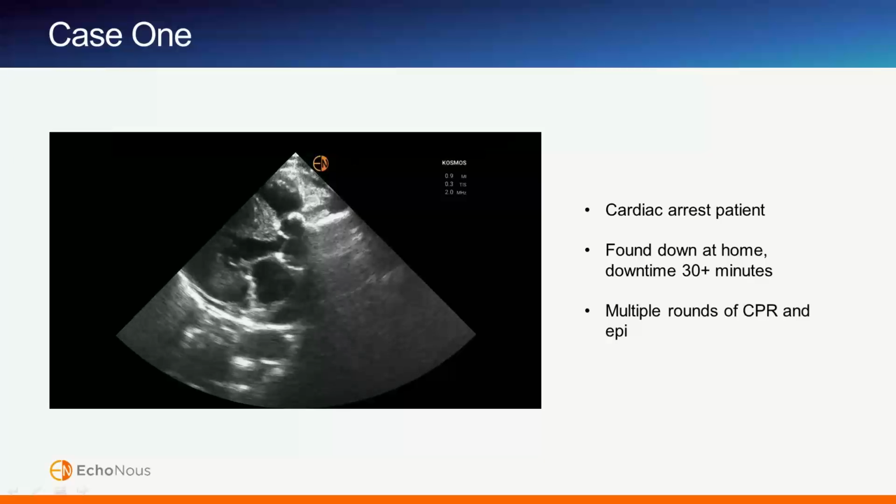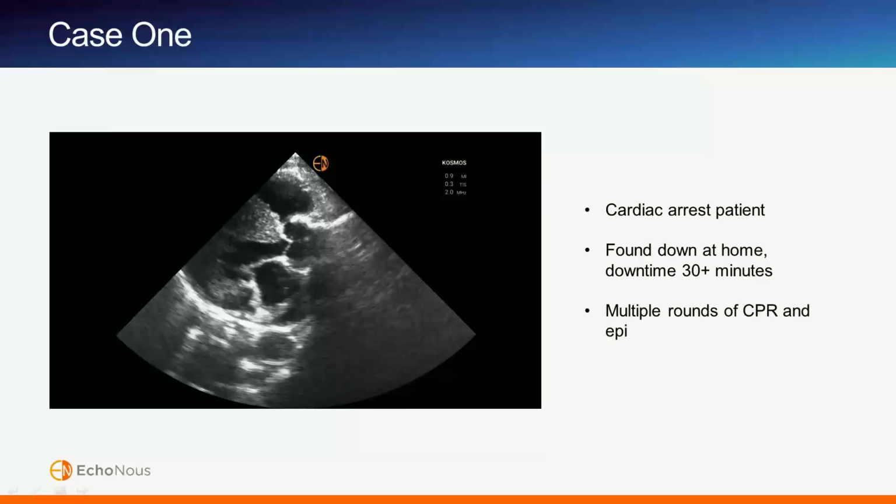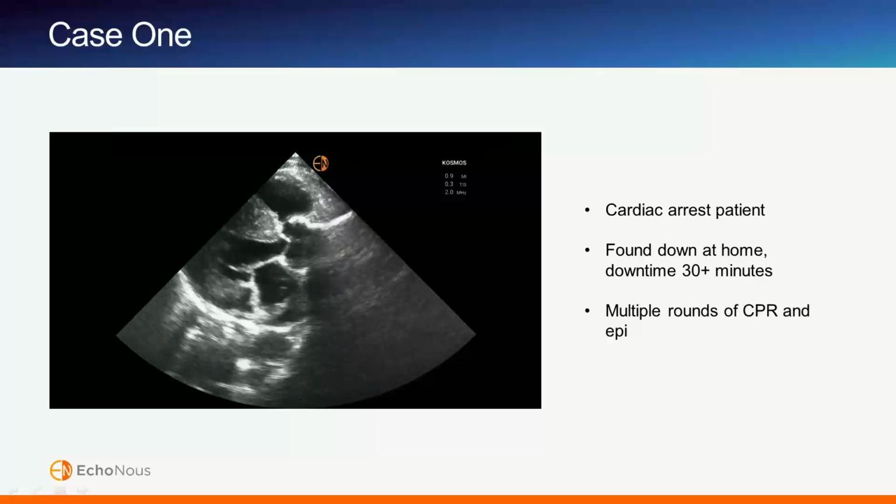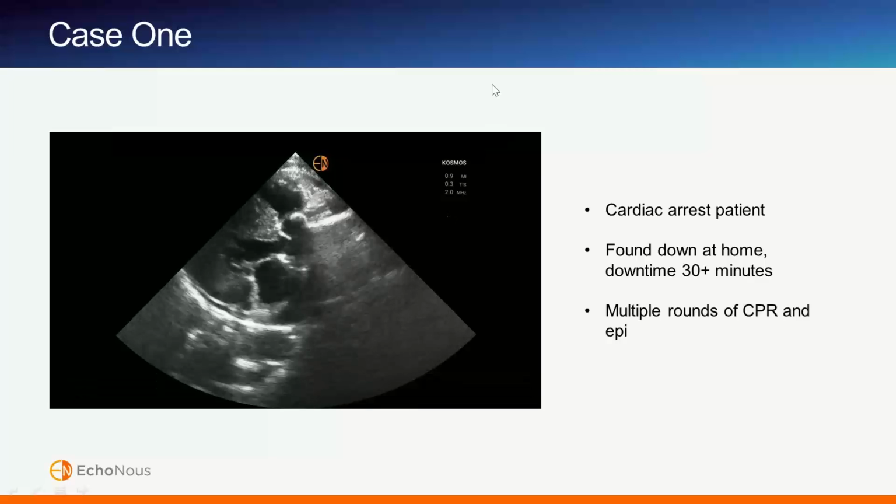And I think, they say a picture tells 1,000 words, and looking at an ultrasound image during that resuscitation really does. Once everyone sees the images, they kind of get a sense of where the resuscitation is going. So I agree. I do the same thing. Yeah. Make sure you save your images though for these ones. Yeah. All right. Let's go to the next case.